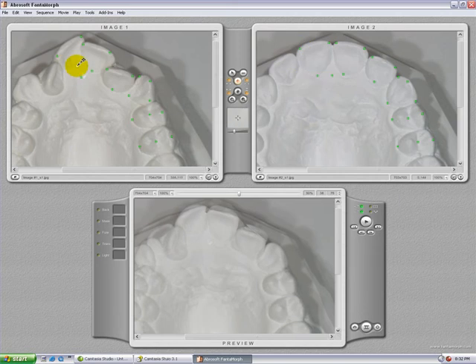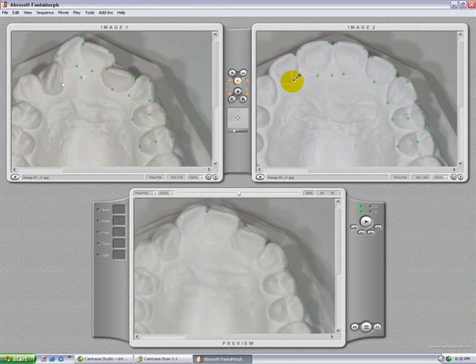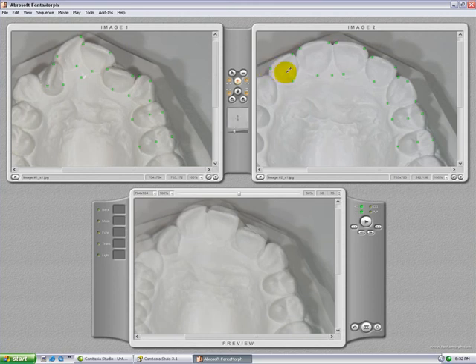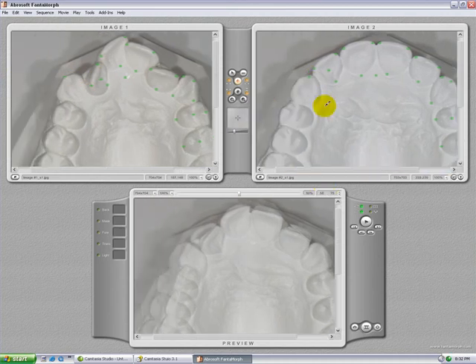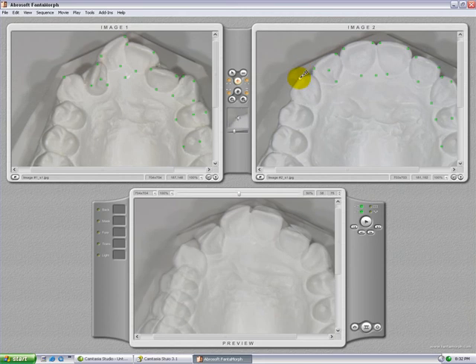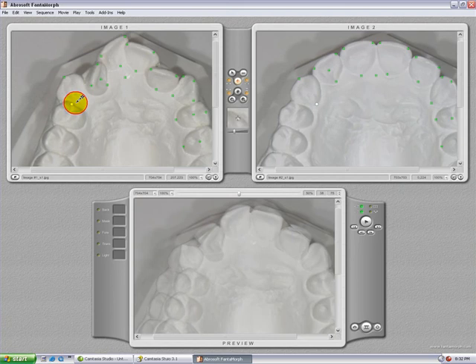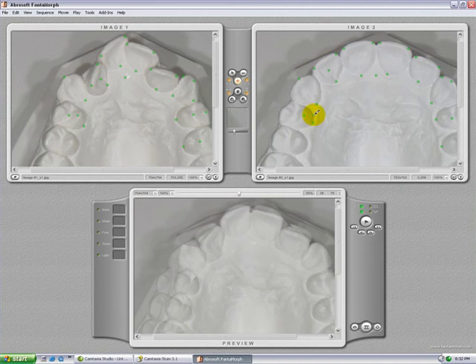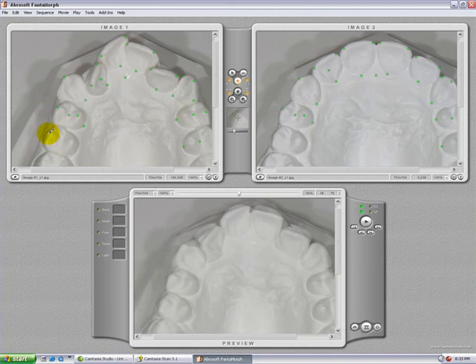If possible, place more than a single landmark on every tooth. To correct the position of a landmark or green dot, click on that dot until it turns white, hold your left mouse button and move it to the correct location, then release the mouse.